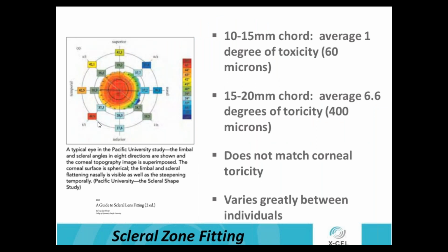So moving again out to the edge, and really, if you've ever fit sclerals, and even if you haven't, it's good to know that the edge is everything. Most designs are going to be very similar from the edge in. So your central zone and your limbal zone are very similar in their abilities. We have some unique situations with ours, but the edge is the most important. I told you that most of the changes will come on the edge. So it's important to know what we're looking at and getting as much information as we can outside that limbal, where the lens is going to land.